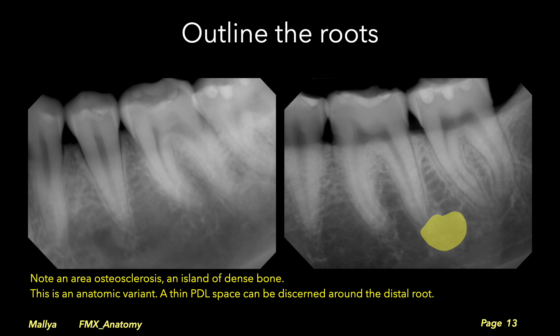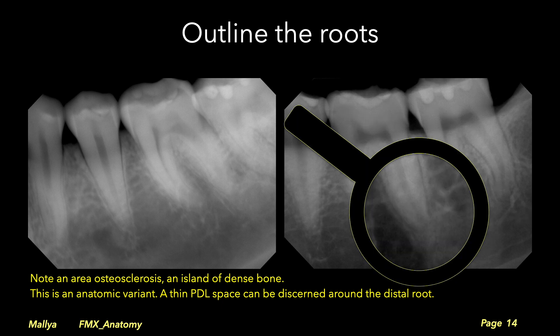Note a diffuse radiopacity adjacent to the distal root of the mandibular first molar. This is an area of osteosclerosis, which is an anatomic variant. You should visualize this area in more detail to ensure that an intact laminar dura can be traced around the root apex.